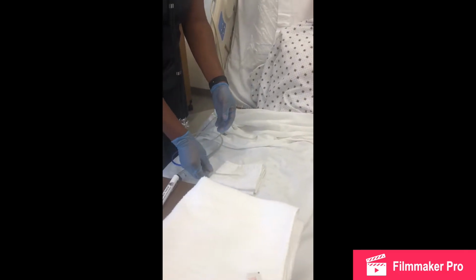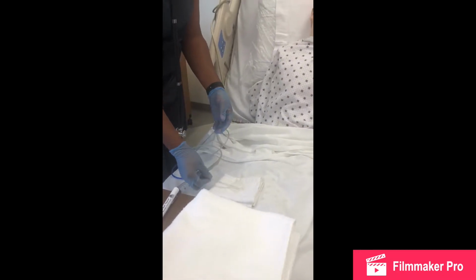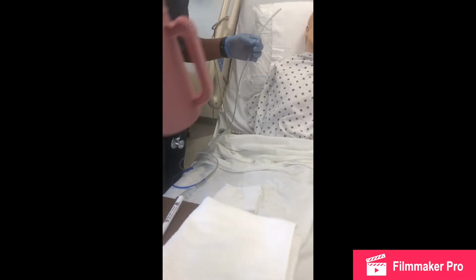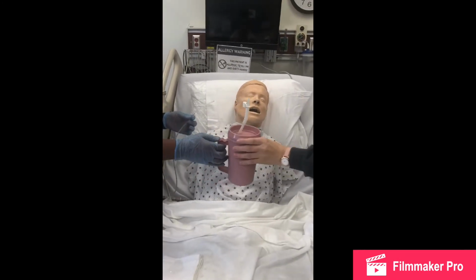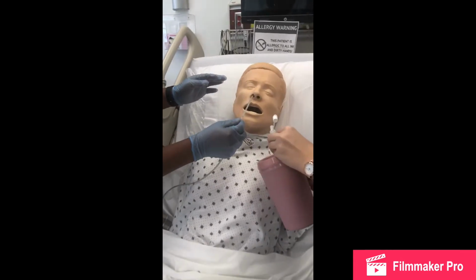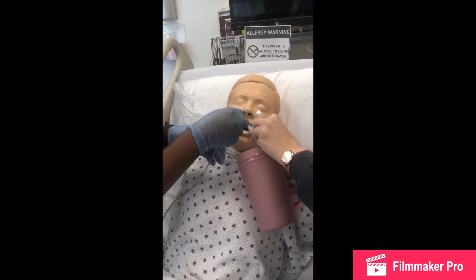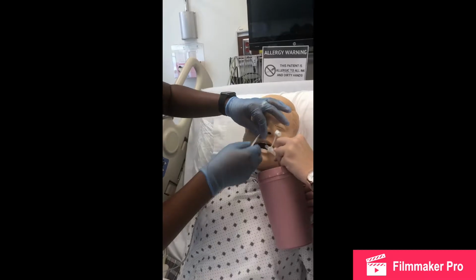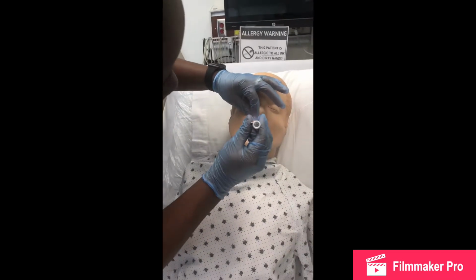While inserting the tube, I'm going to make sure that my patient has sips of water to help the tube go down easily. So I have my jug with my water. Now I'm going to have a nursing student assist me with the process. While entering, I'm going to make sure the patient is aware that I'm entering. Carefully enter while you're taking sips. Once I reach the back of the throat, I'm going to use my pen light just to make sure it's not coiled.